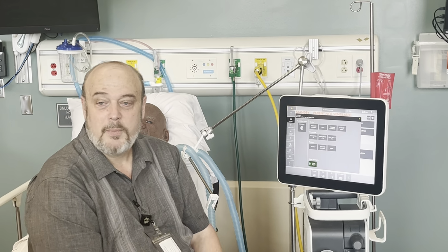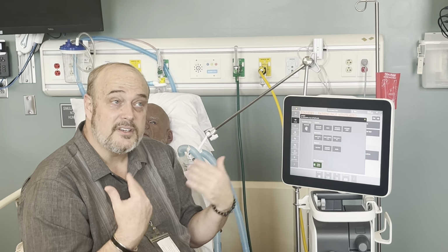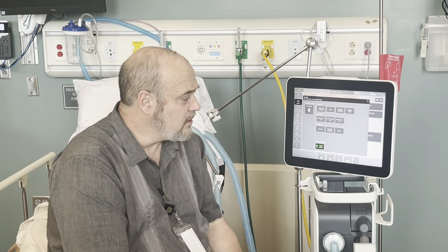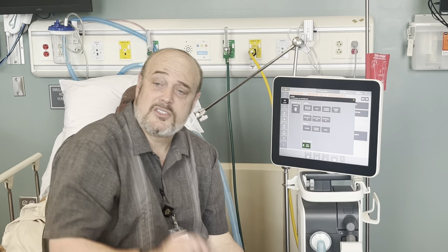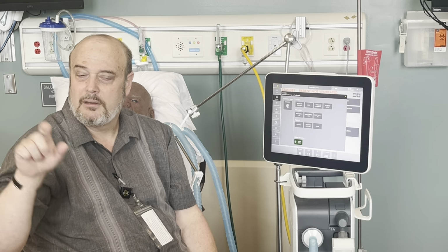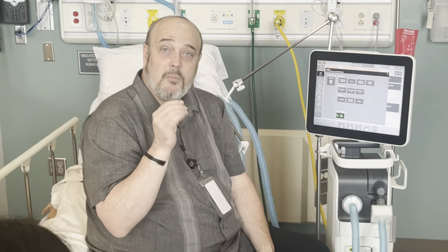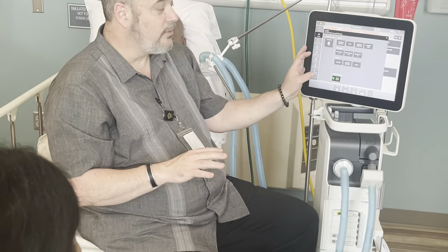So then it's basically coming up here, and the thing I want you to do is be able to look at the ventilator, read the output that is given to you, manipulate it best for your patient. Because you can take a patient who, I remember, she had an I time of 1, and you can see on the waveform a little bump right there. That was her exhaling before the breath was done. And so I went from 1 to 0.9, smooth after that, she calmed down and relaxed. Because once you have all your settings in here, doing what you wanna do, then you go in there with the waveforms and things.